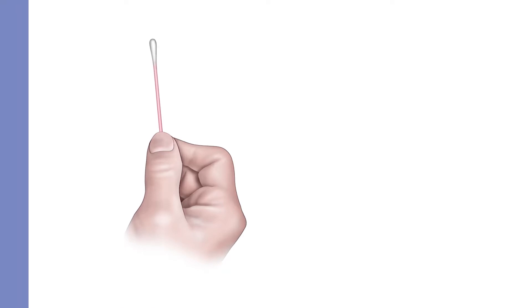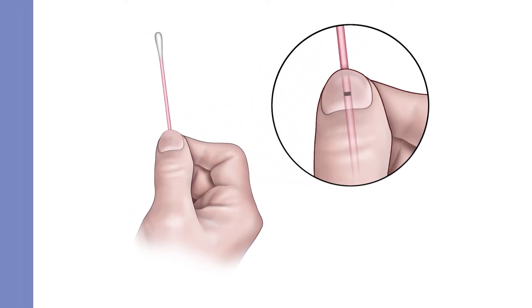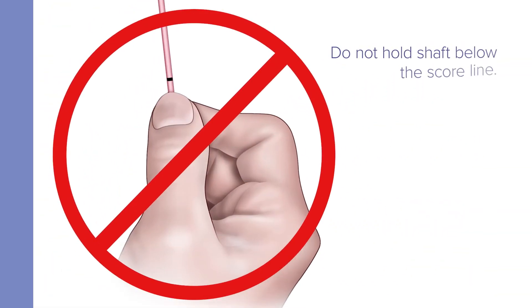Hold the swab with your thumb and forefinger in the middle of the swab shaft over the score line. Do not hold the shaft below the score line.